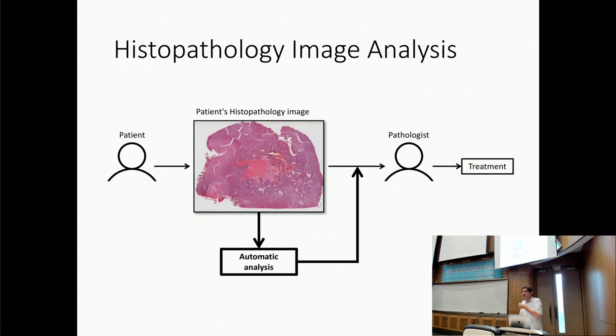But now, there are scanners where you can take the piece of tissue on the glass that has been chemically treated to look at under the microscope, and the scanners will actually take an image of it. And this image is not the size of the images that your cell phone takes. I know that the Korean companies now make cell phones with really high resolution. But here we're talking about images that are about 100,000 by 100,000 pixels. So Samsung's not there yet, at least not on the phone. They might be making scanners, but that I don't know.